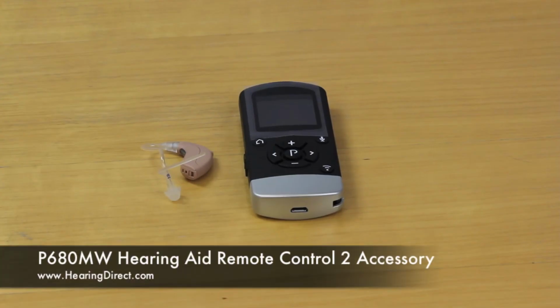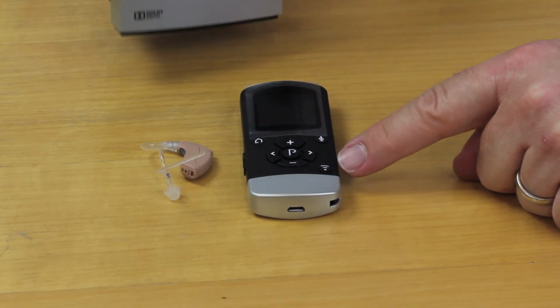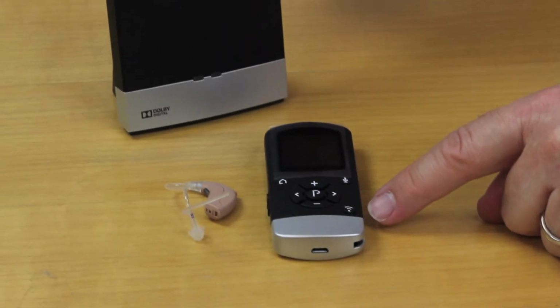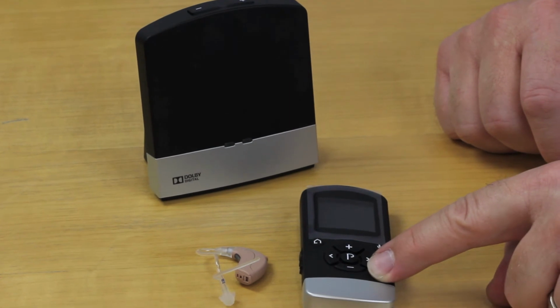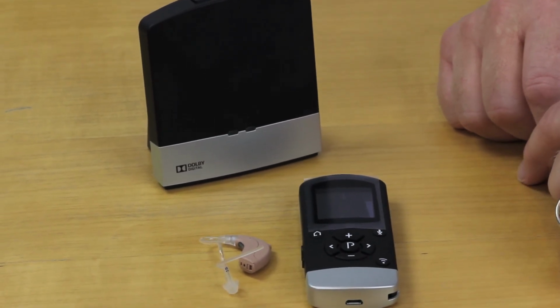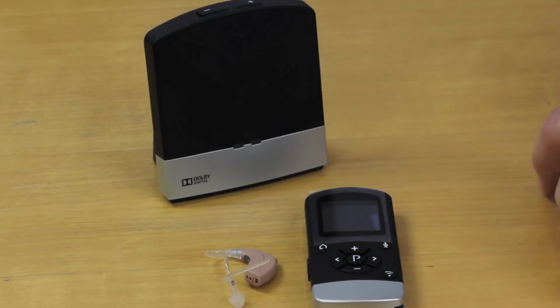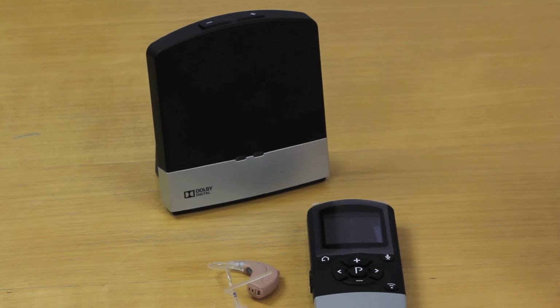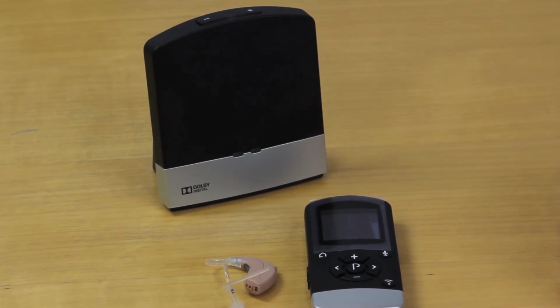The streaming button may be used to activate audio streaming from the TV, stereo, or another device connected to your hearing instrument. Simply turn on the audio device and then press the streaming button. The hearing instruments will instantly start searching for the wireless accessory, such as the TV streamer, and connect to it. You can have up to 3 streaming devices set up for your hearing instruments.